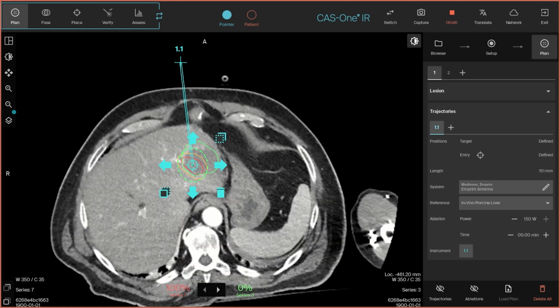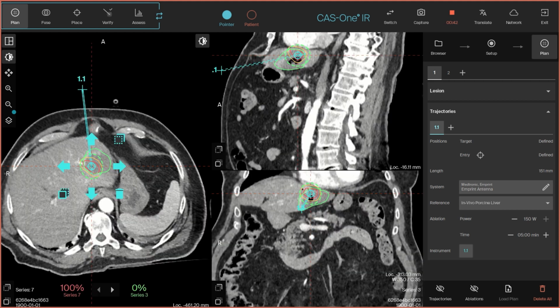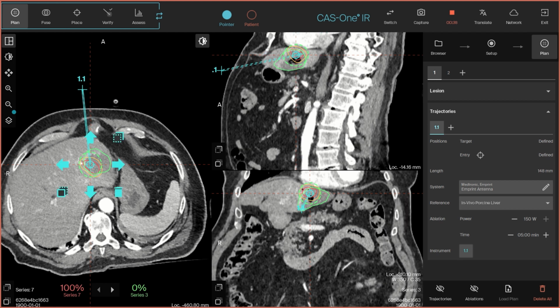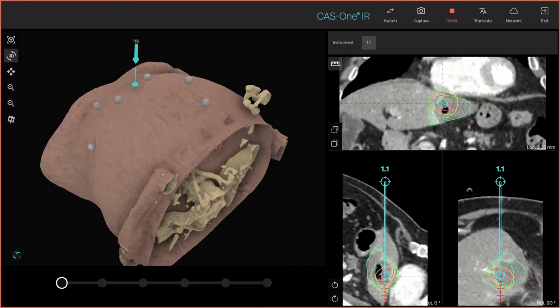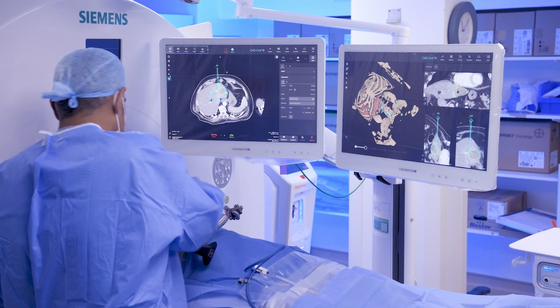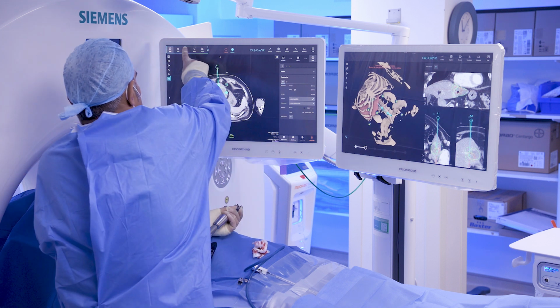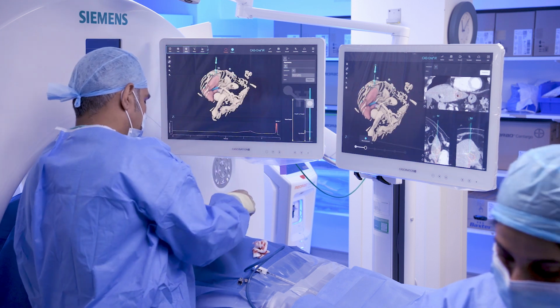So within this, I think we ought to target in and around the lateral aspect of that ablation cavity. And I think that's probably what we will be looking to do. So we will re-zero.